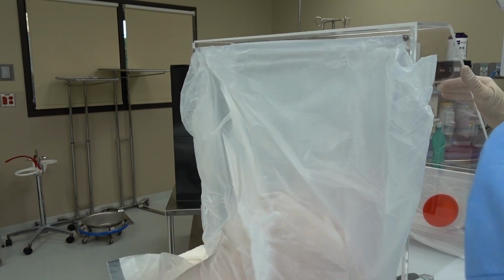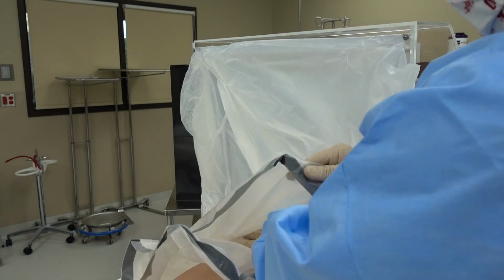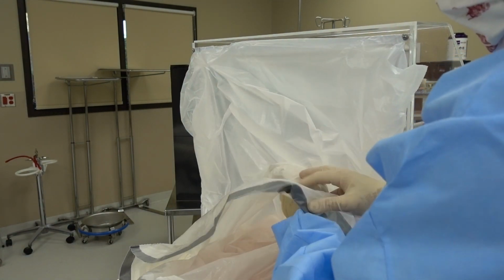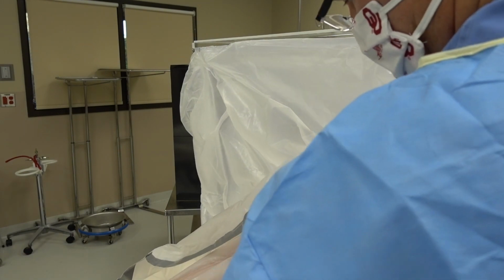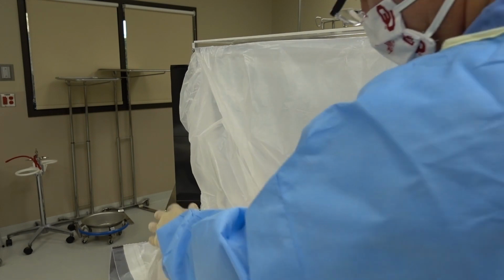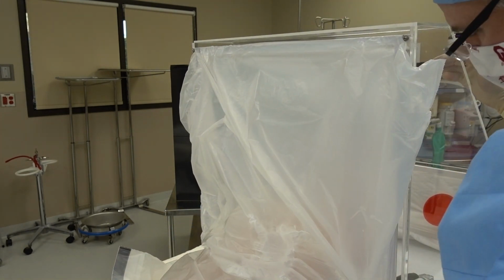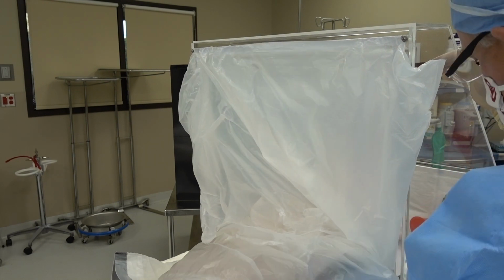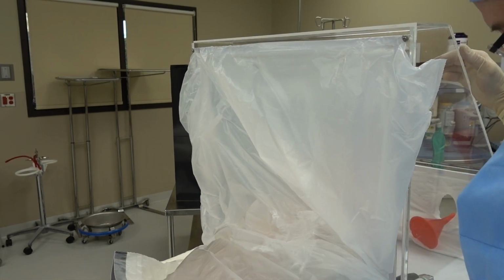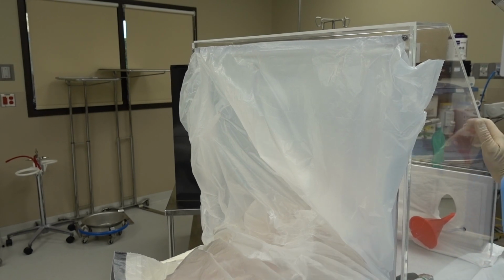Now this bag is huge and it'll work on anybody. You can have anatomy that's quite large and this will work. And this bag will seal. You can use it as a child and just close it. You can throw a blanket over it. Your assistant can actually reach in through the bottom and help you. They can help get you better visualization. They can use the ambu bag, depending on which side, and they can see what they're doing.